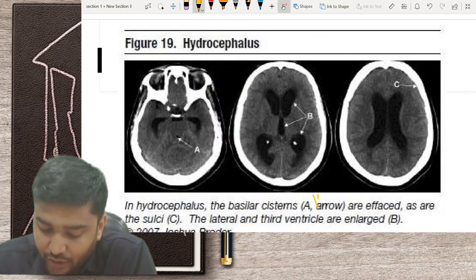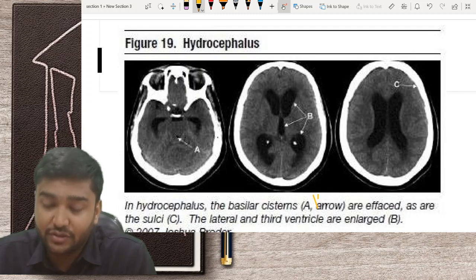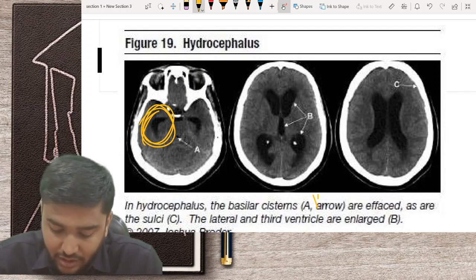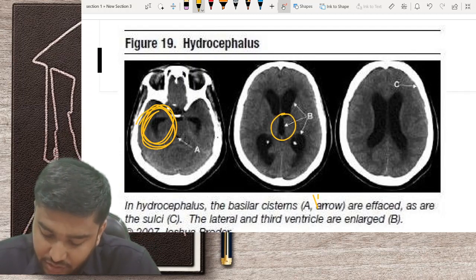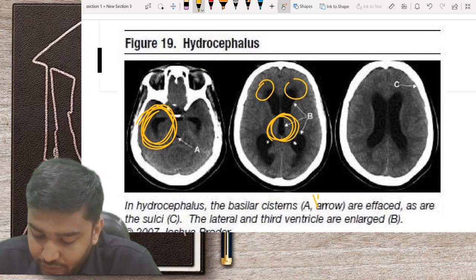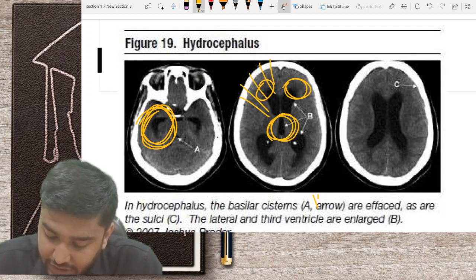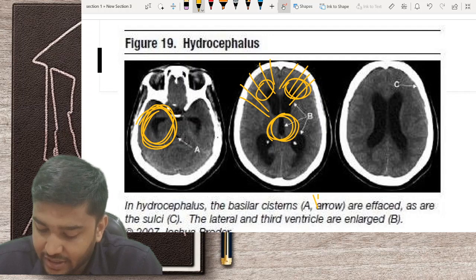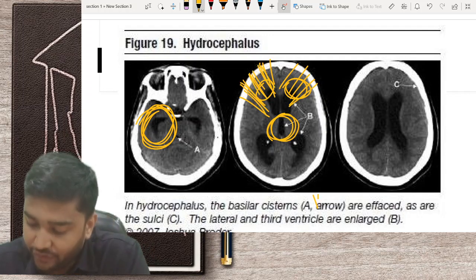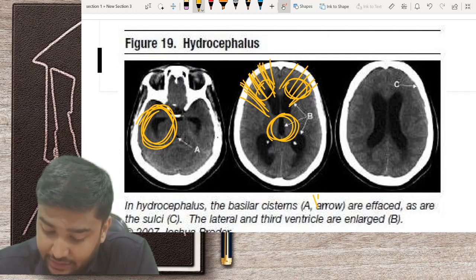Hydrocephalus: there are a few key signs to identify hydrocephalus on CT. The temporal horns will be enlarged, the third ventricle will be enlarged, there will be cupping of the frontal horns, and there will be some periventricular oozing through the horns. When you see these findings, you must state there is hydrocephalus with raised intracranial pressure, and you must intervene.